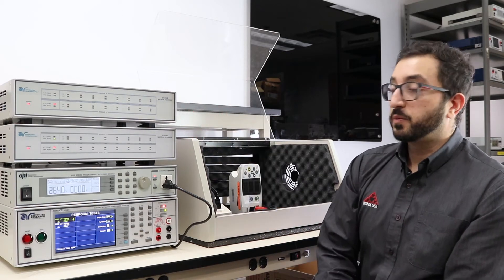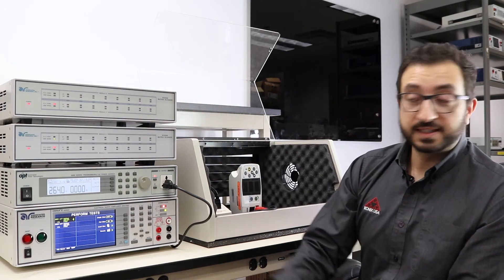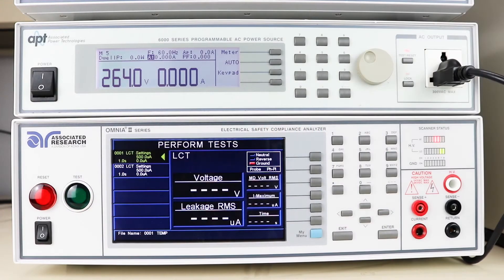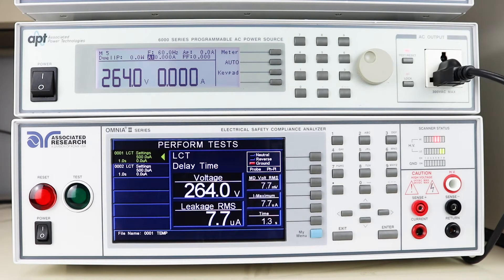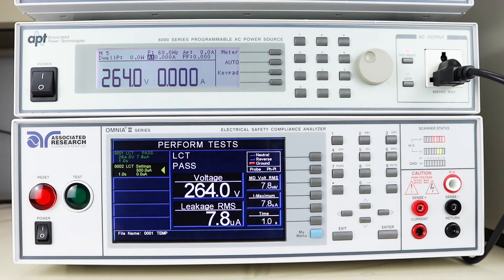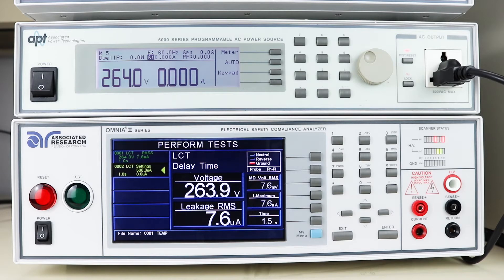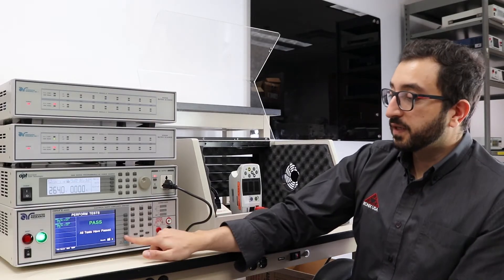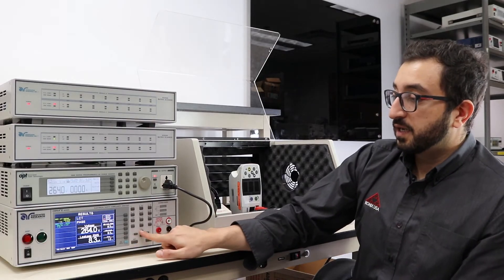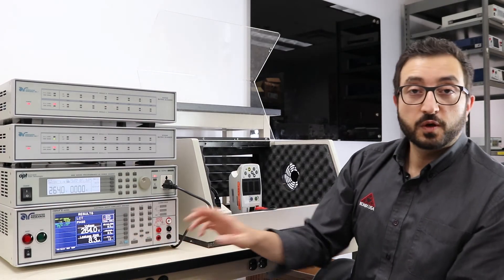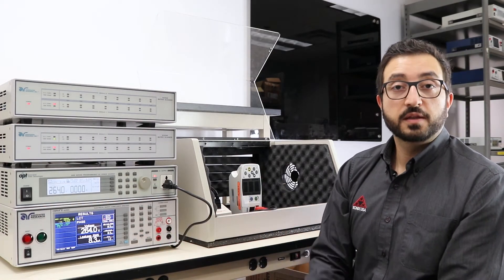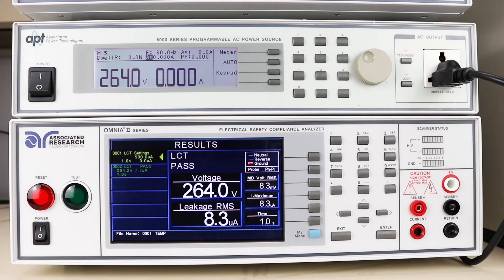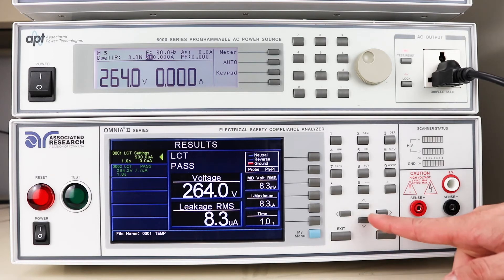I'm going to start the test. Let's take a look at the results. The first step was performed in normal polarity of T2, and we recorded about 8.3 microamps.